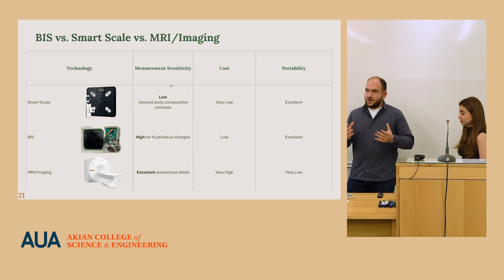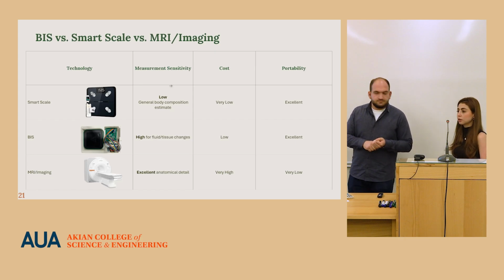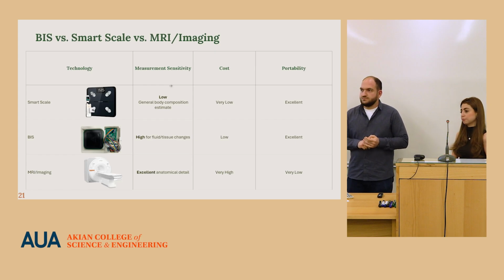After getting the outputs, when we use the result parts of fat-free mass, there we use the statistics of men and women for the same company from their researches to compare which values are normal for the healthy people and for the unhealthy ones. So we used statistics there.